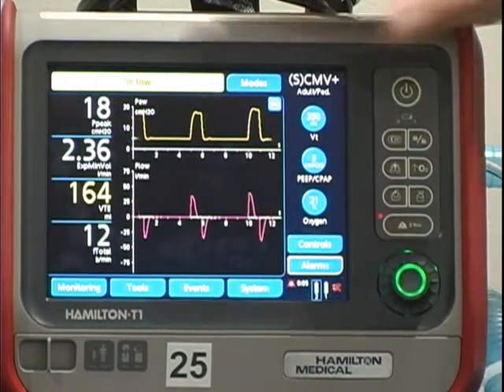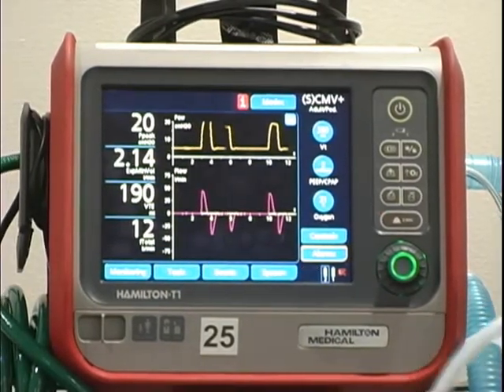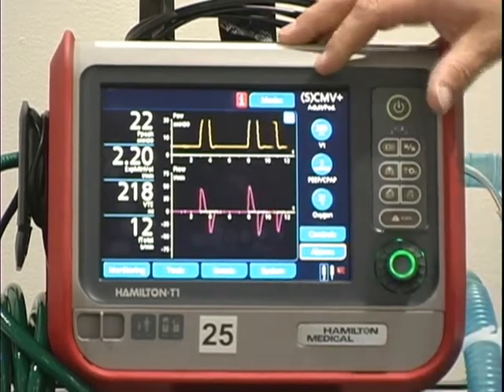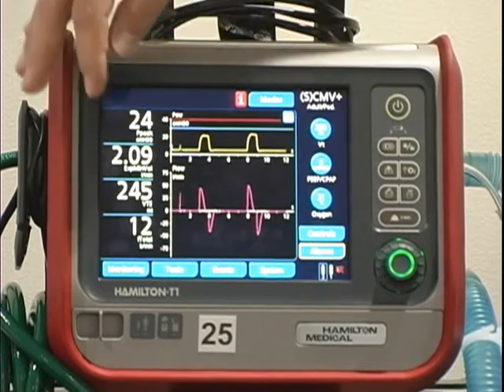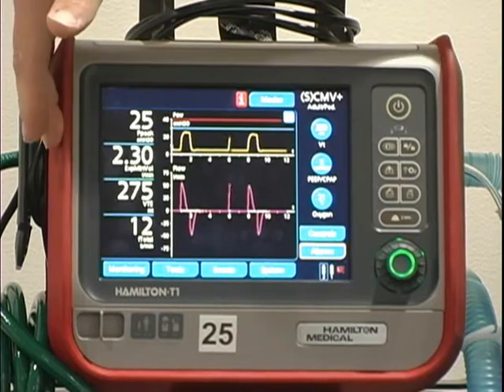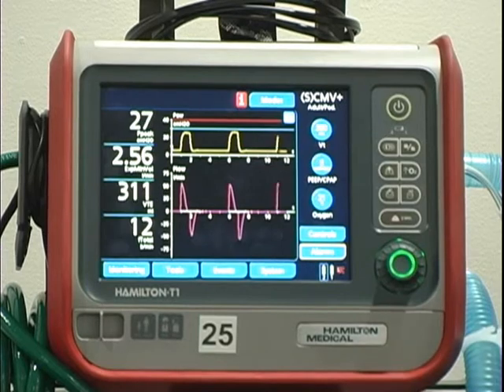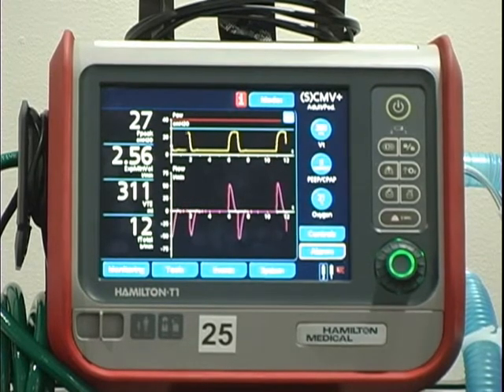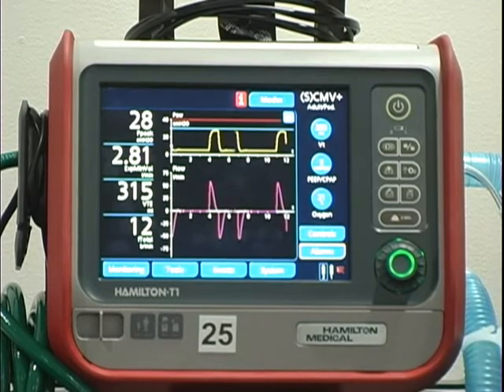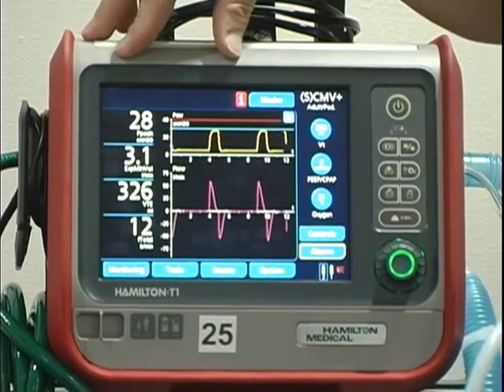Other alarms associated, so right now we have the low tidal volume. There is a patient disconnect alarm, which could occur if our patient were to take a larger tidal volume than what we have set significantly. So if we had 300 set and your patient were to wake up and take about a 600 breath tidal volume, it would alarm patient disconnect, and obviously you would look at the ventilator and say they're not disconnected. That's just because they've pulled all the flow and volume out of the circuit. So no need to correct it. It will correct itself as you've seen the other alarms correct.